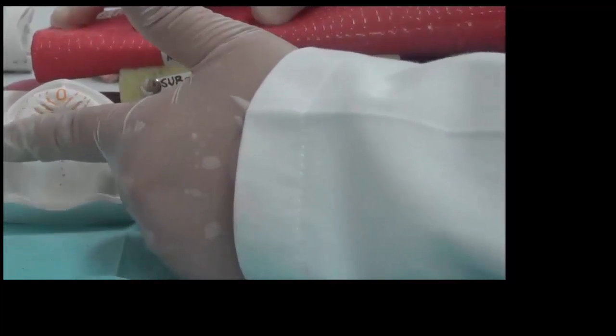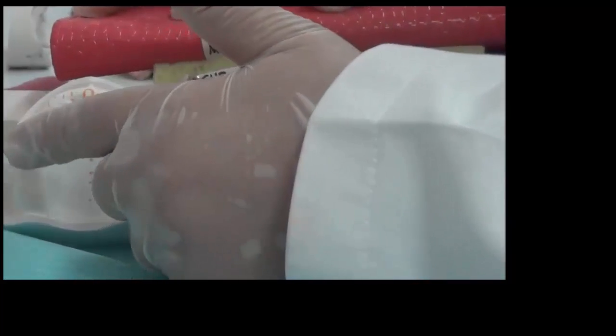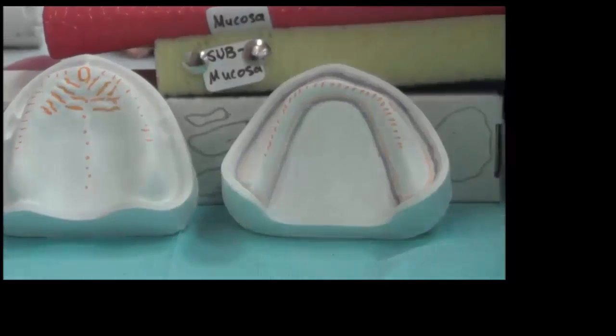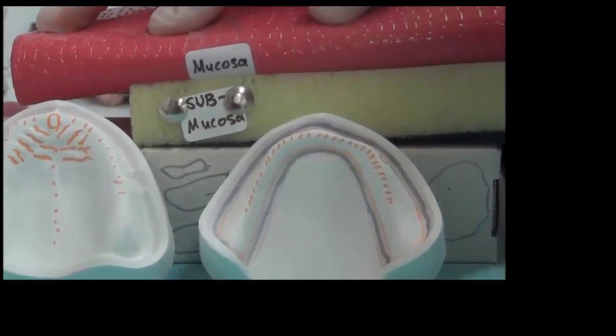So we try to relieve the crests of the ridges, even if they are not knife edge shaped, because in the long term they tolerate the pressure less. That means they will resorb more. If I exert even pressure all around, these areas will resorb faster because of the quality of the bone beneath. So in these areas we relieve, while on all of the slopes of the ridges we have good compact bone, and we can pressurize as much as possible.